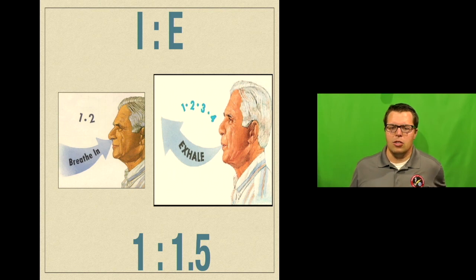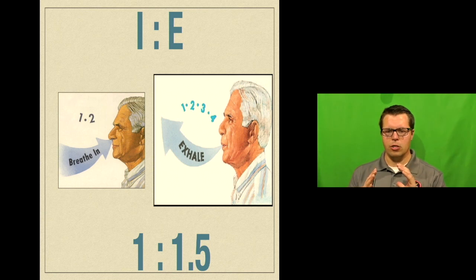Now that may change if you are heavily sedated and ventilated. The mechanics of it may actually be a little bit more beneficial if you go closer to 1 to 1. If basically you need more support from the ventilator or you have less respiratory drive, an I to E ratio closer to 1 to 1 may be better. If you have obstructive lung disease, an I to E ratio of maybe 1 to 4, where you need much more time to exhale, may be beneficial to you. So for most of us, again, if you had to pick something, 1 to 1.5 or 1 to 2 in a person that you don't know otherwise is a reasonable place to kind of get started with it. But that's I to E ratio.